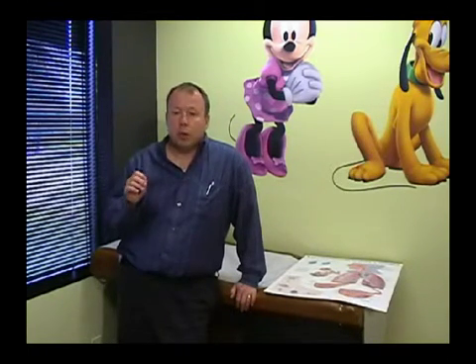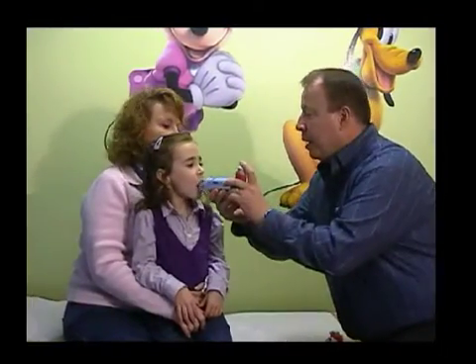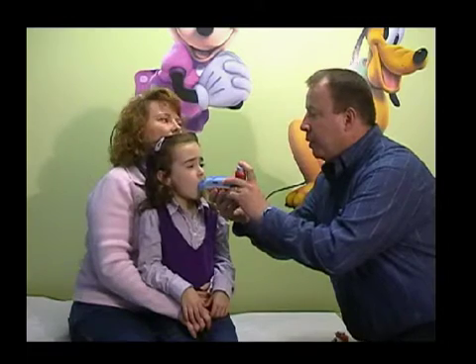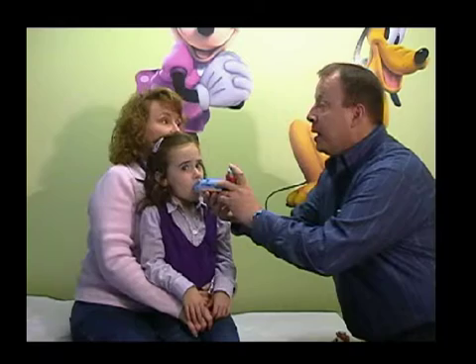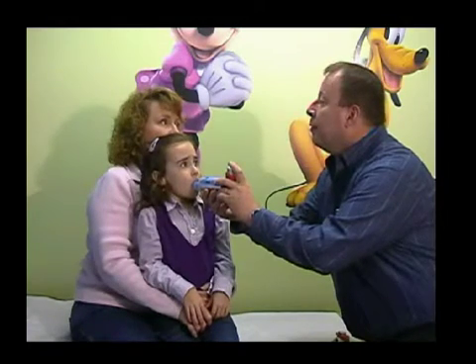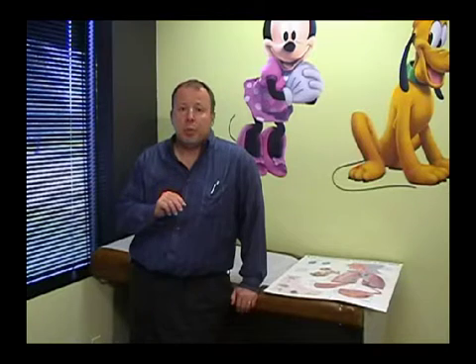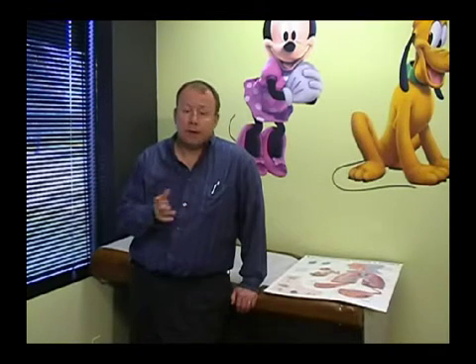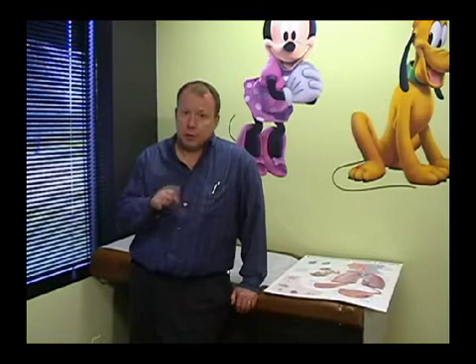When we're using albuterol by the puffer and spacer, you do your shake, you do your puff, let them breathe in, hold it for 10 seconds or take multiple breaths if they're not able to cooperate with that. Wait a minute, do your second puff. We give it 1 minute until the next puff, and we do it in 2 puff groups. After you've done your 2 puffs, you give it about 5 minutes, and if you're all better, you stop at that point. If not, then you give 2 more puffs.